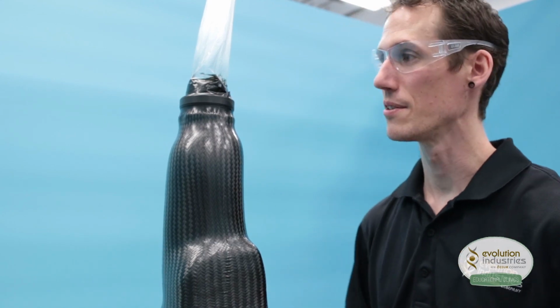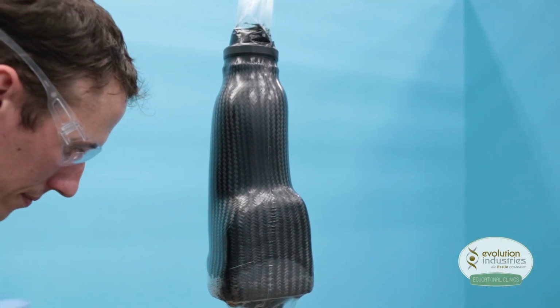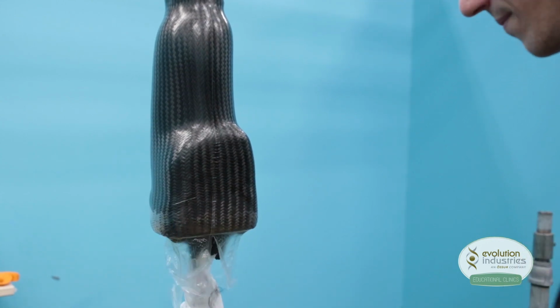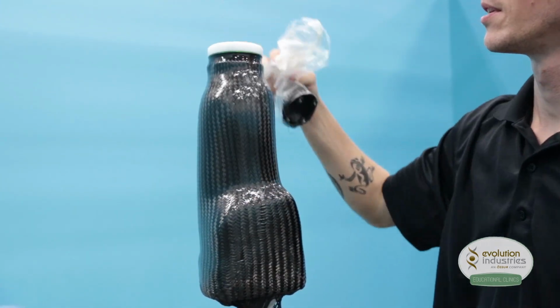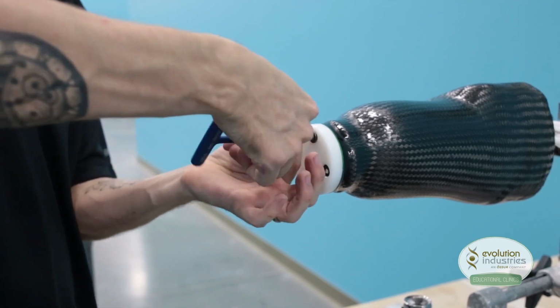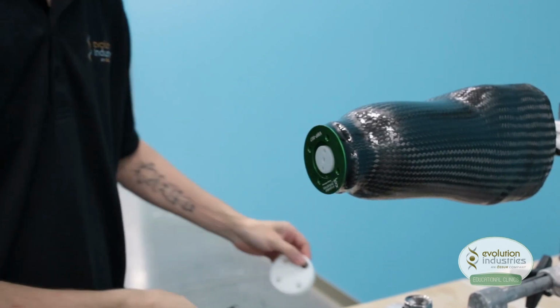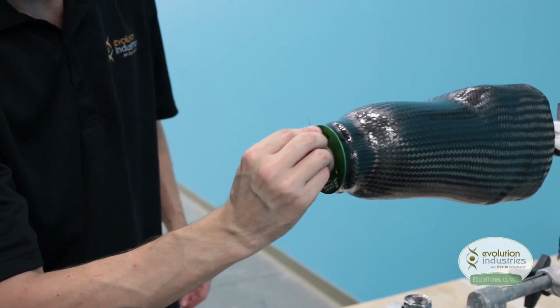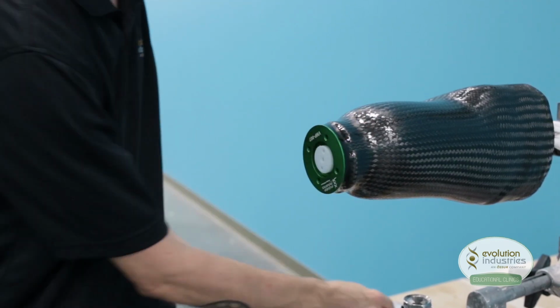Now once the lamination is completely set, you can remove your PVA bag. And when you remove it from the proximal, you can remove the excess resin and have access to the screws to remove lamination dummy. And now we can remove our lamination dummy. And if you have any resin at all that might seep through, you can just use a razor blade and just shave it off. You have a nice clean surface.